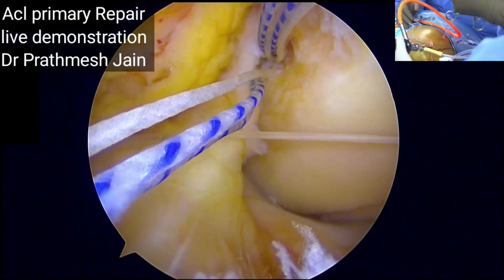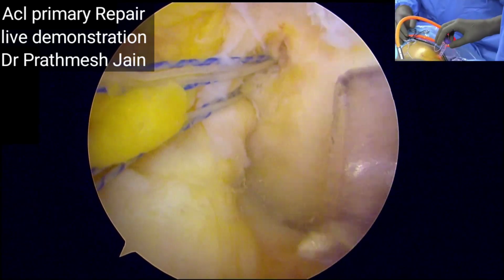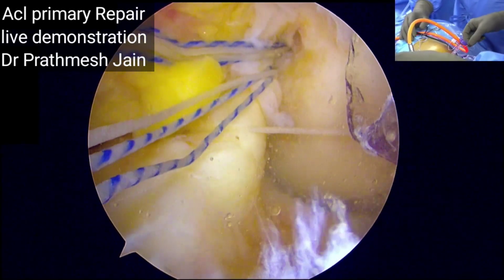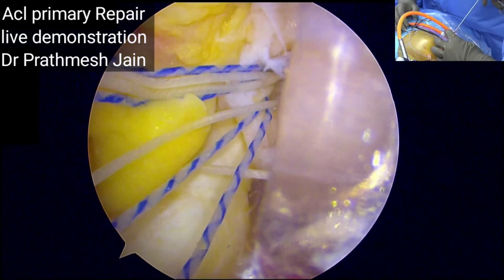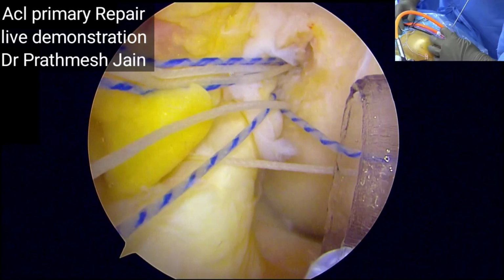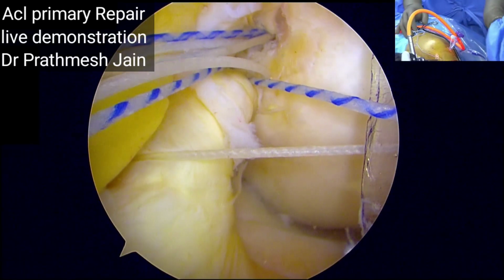This first suture will actually bring my ACL into a more normal position. If you can appreciate, the ACL which was folded back now is in a more normal position. We are able to see the ACL more normally. You can see the substance of the ACL more normally as compared to before.